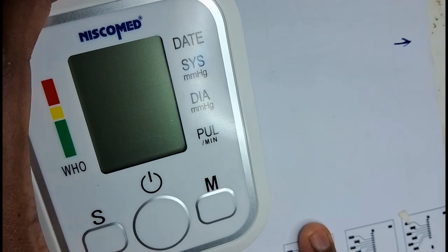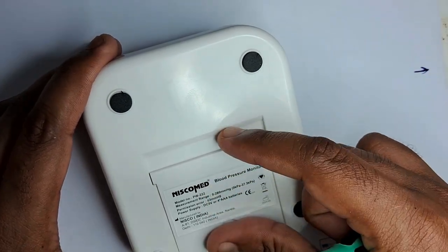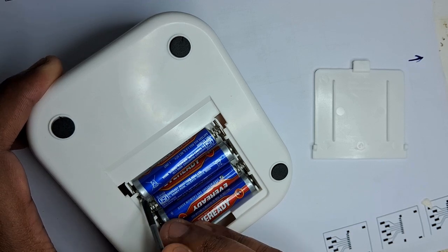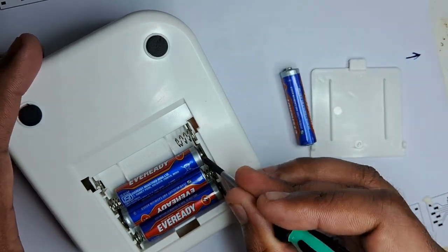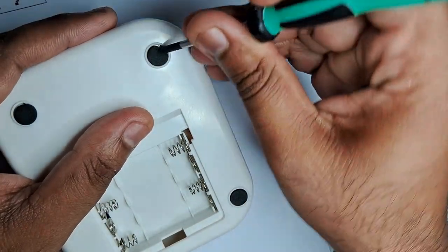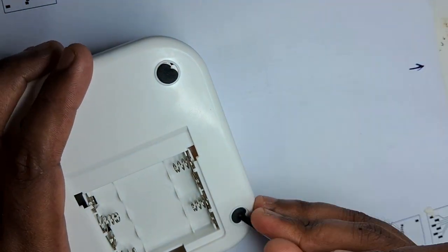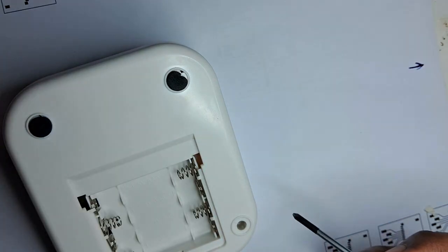So let's focus on tearing it down. Let's see from where it can be removed. Oh, this is there. First, we should always remove the battery. Okay, this is the very critical component whenever you are trying to open, repair, or fix anything. Now we will find where the screws are. Okay, this does not have that. This should have grooves for making the screw stick.